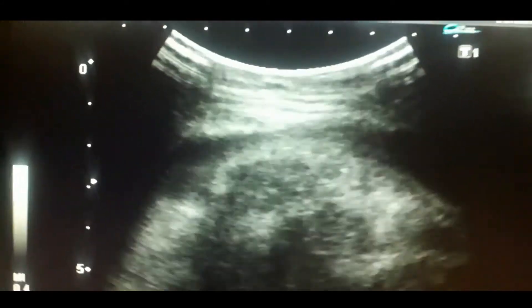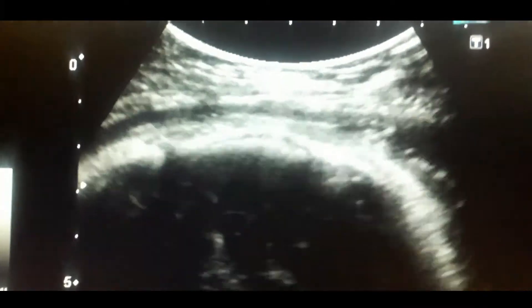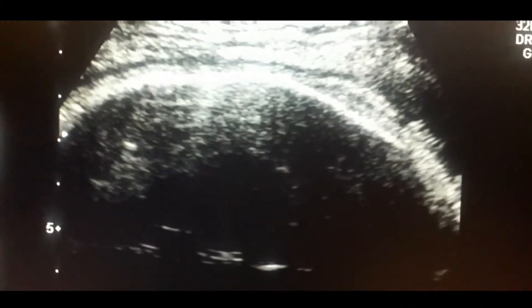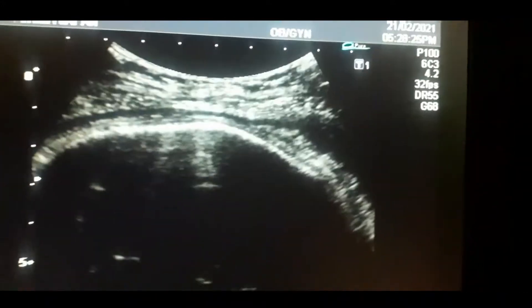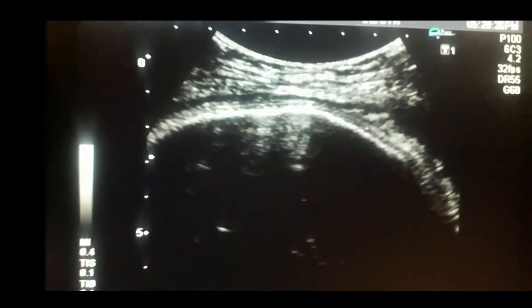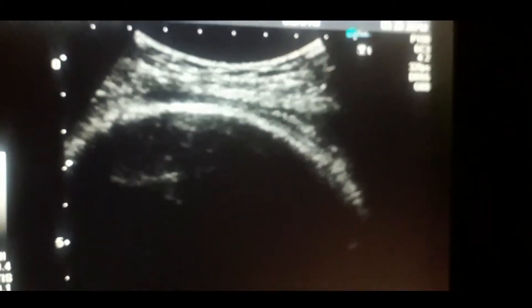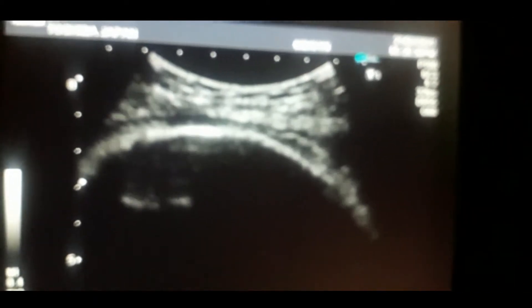Coming to this live case: this is a 36-plus-week pregnant lady who has had two previous C-sections. We would like to calculate the scar thickness. I have focused on the skull of the baby.